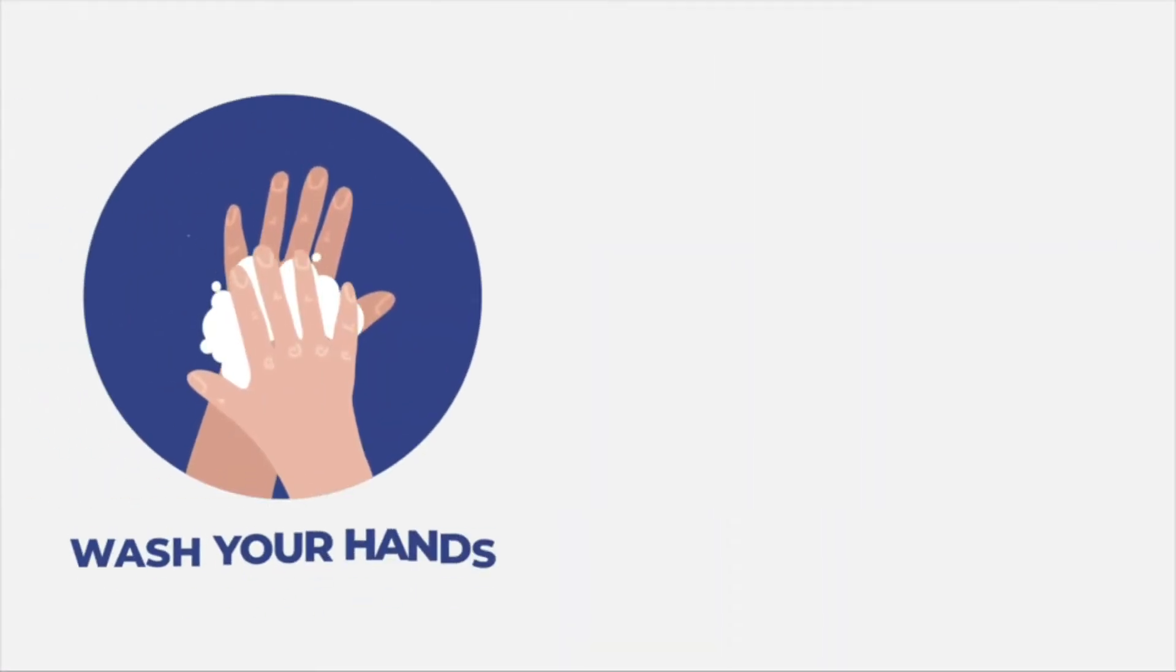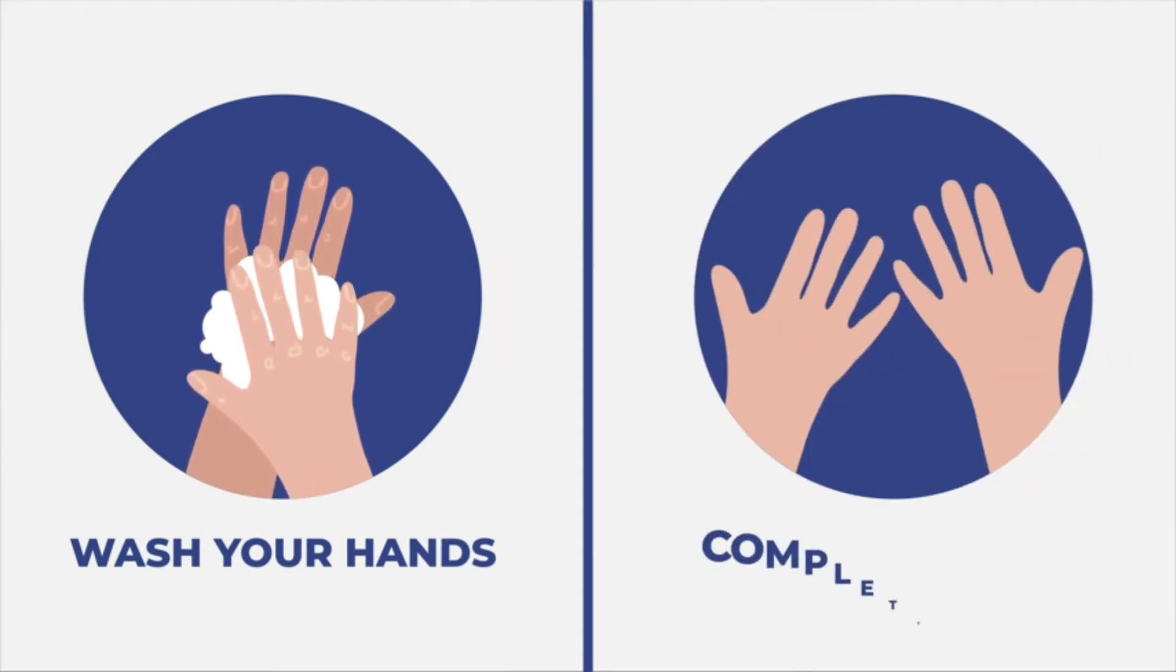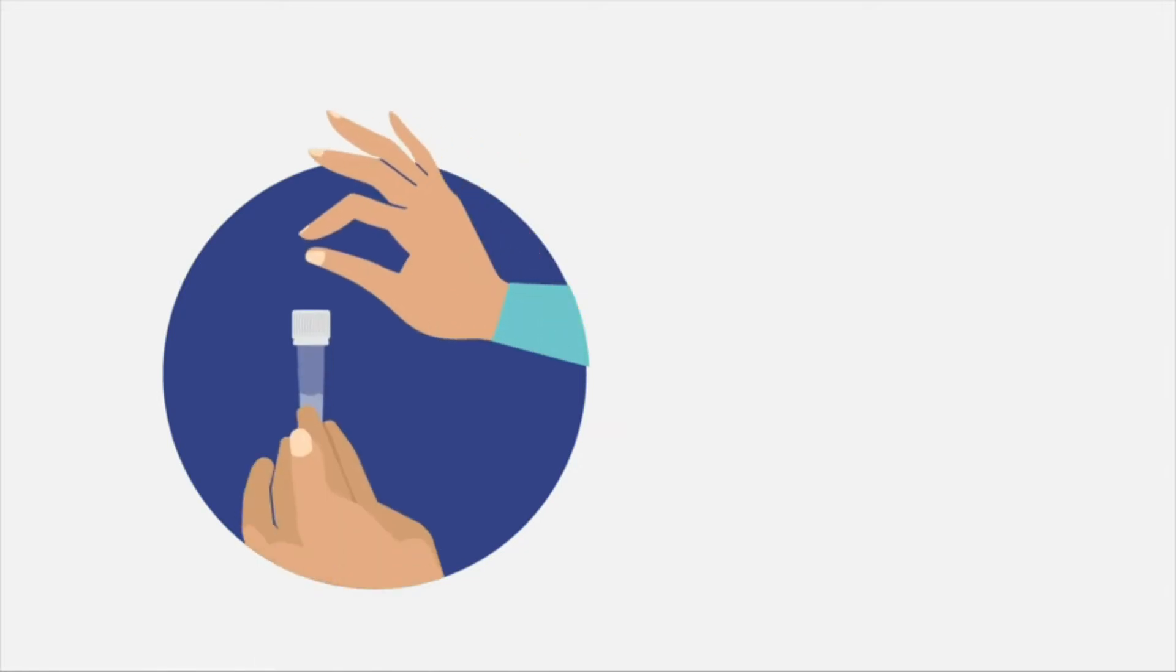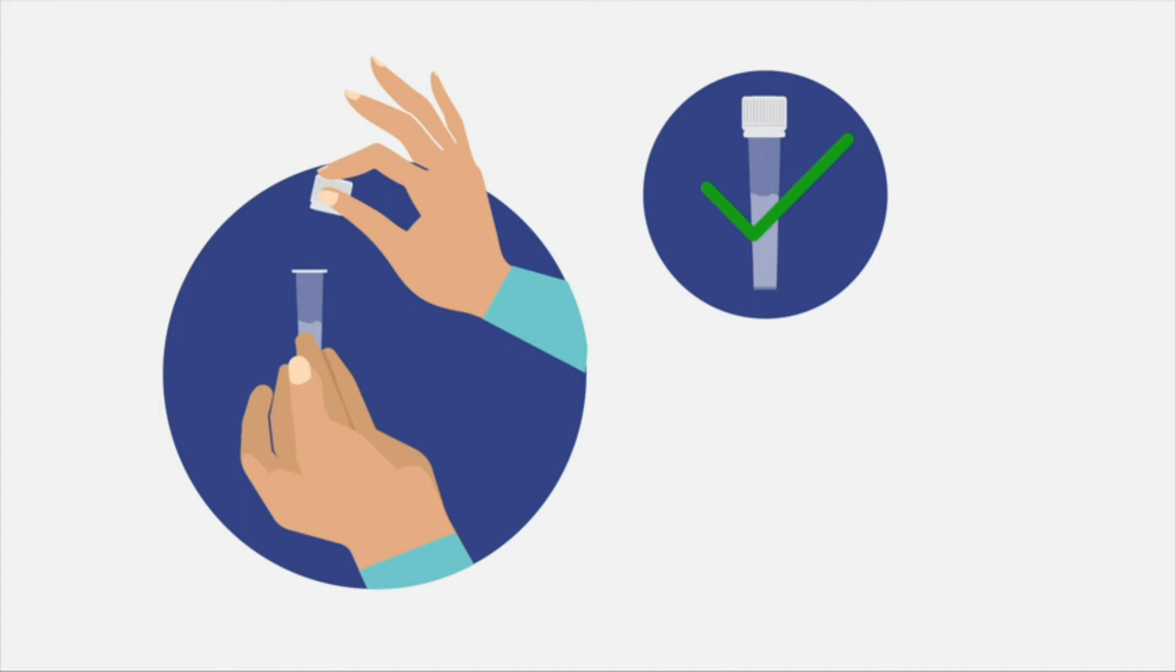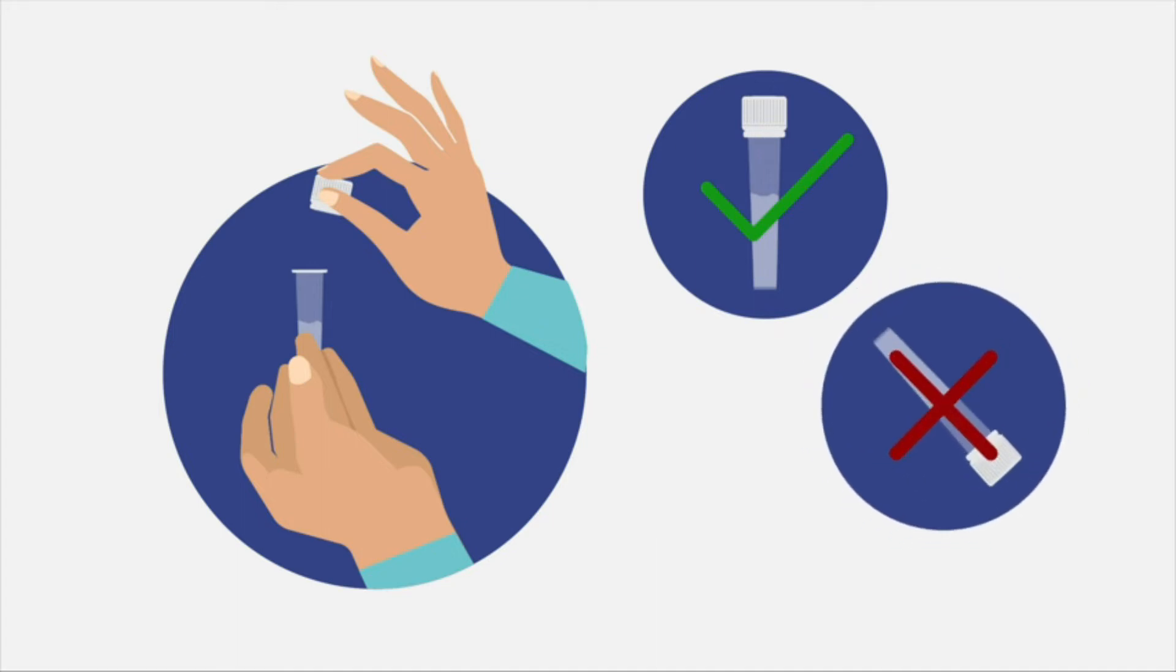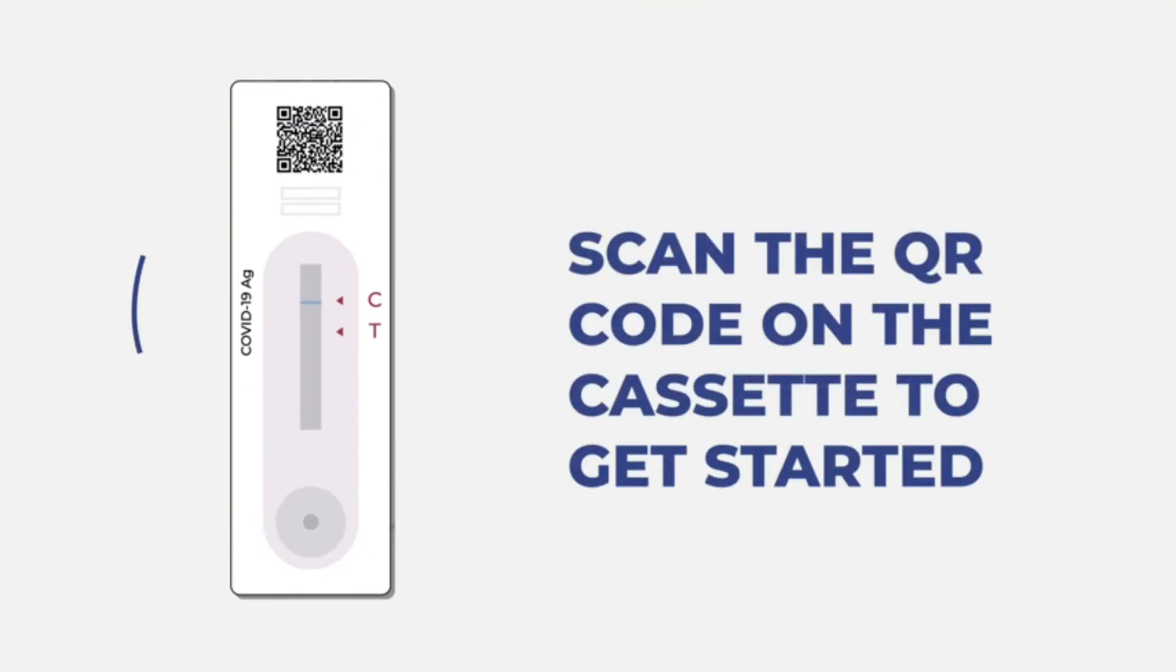Before you start, wash your hands and make sure they are completely dry. Take out the pre-filled extraction buffer tube and unscrew the cap. Hold it straight so that the content at the bottom of the tube doesn't spill out. Scan the QR code on the cassette to get started.